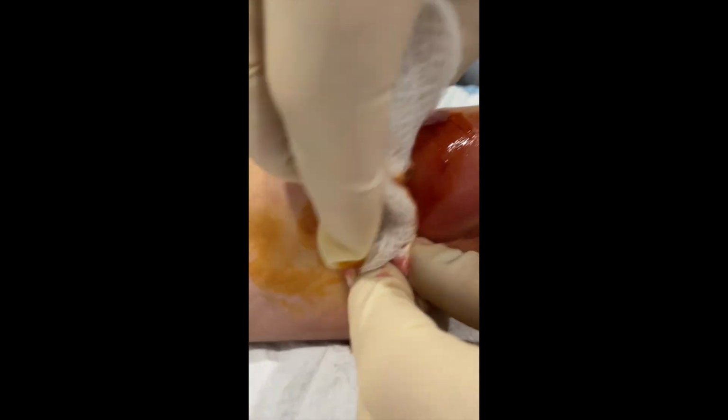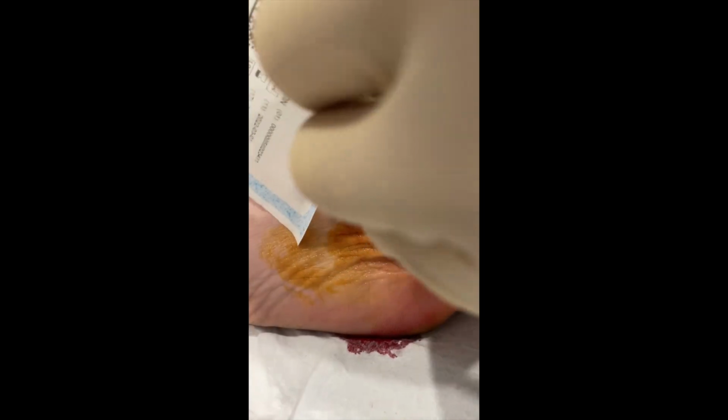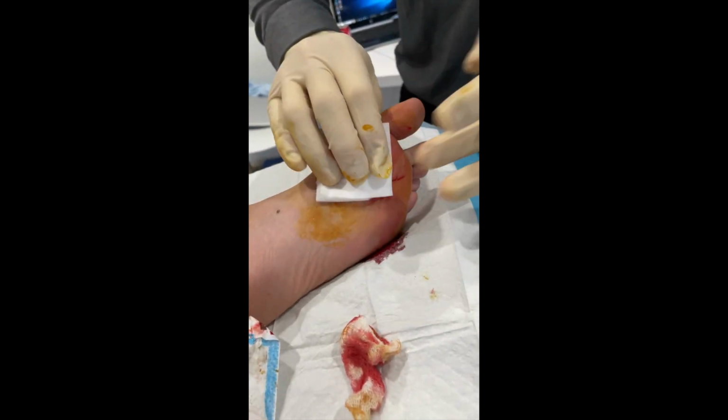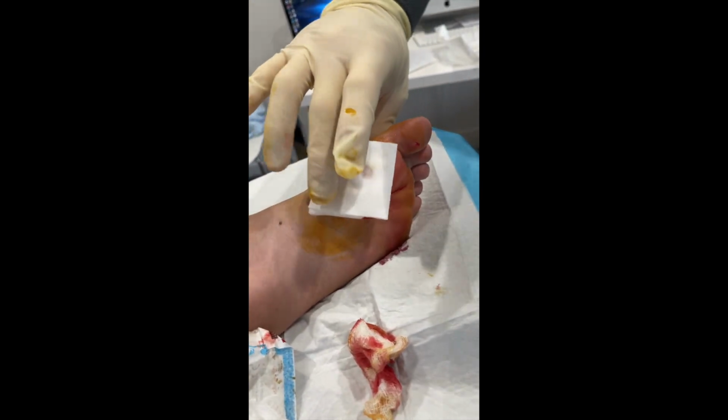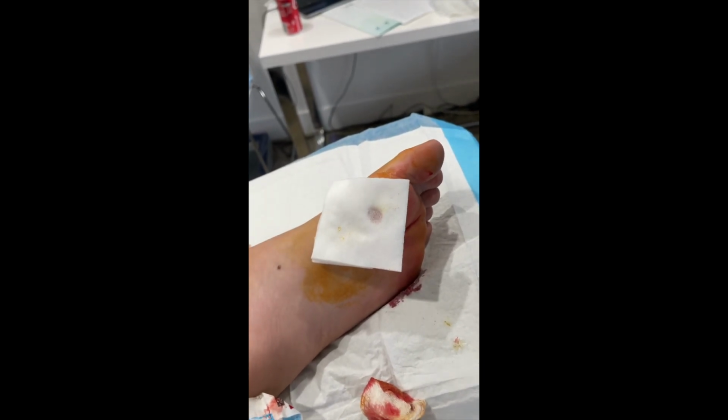I then like to come in and add more betadine just to be better safe than sorry in terms of infection through there. As you can see, the wound will continue to bleed a fair bit, and that's absolutely normal for this type of procedure. Again, a lot of capillary heads through the area that promote more bleeding.